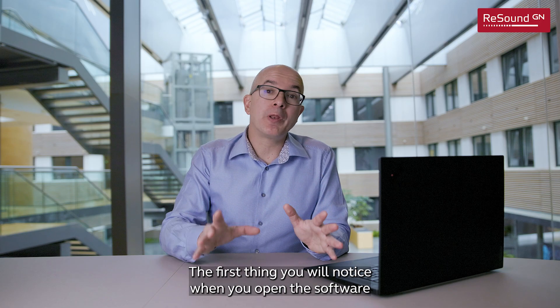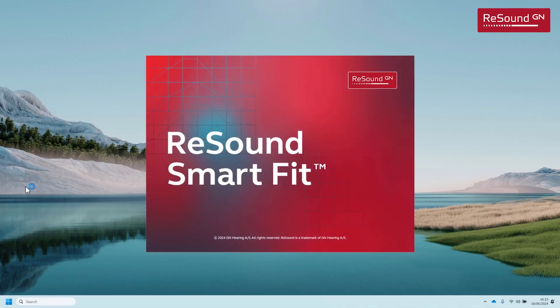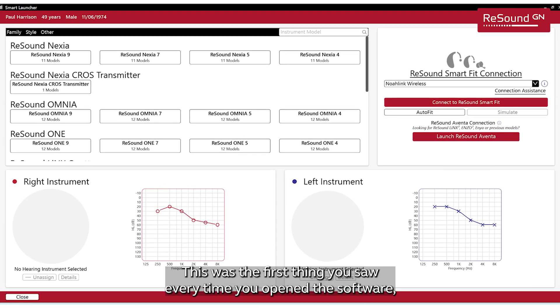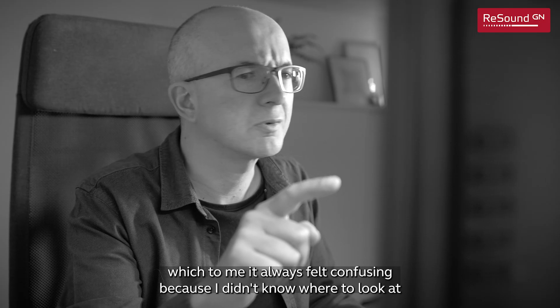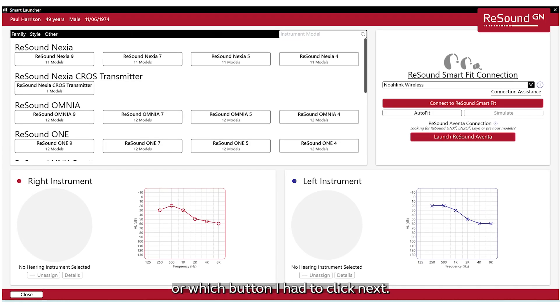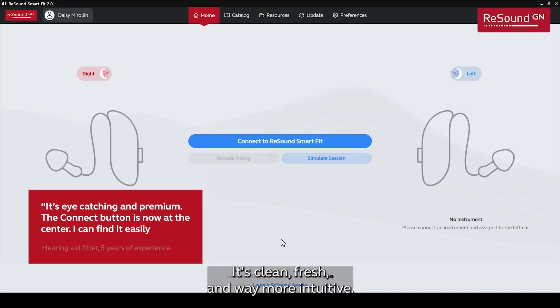The first thing you will notice when you open the software is that the home screen has been completely redesigned, and I cannot be happier about this one. This is how it was in previous versions — the first thing you saw every time you opened the software, which always felt confusing because you didn't know where to look or which button to click next. And this is how it looks now. What a difference! It's clean, fresh, and way more intuitive.